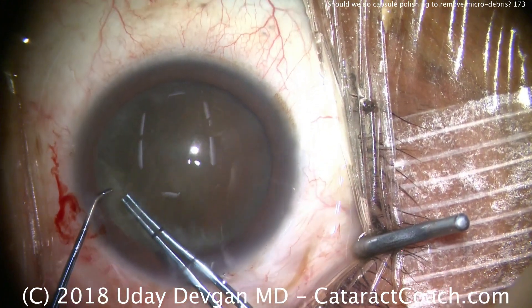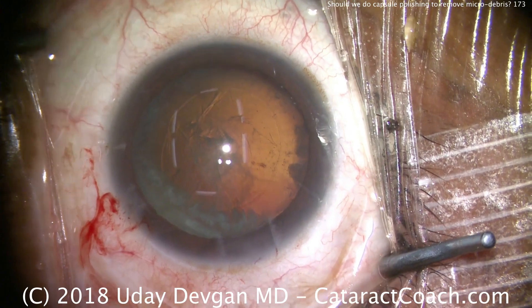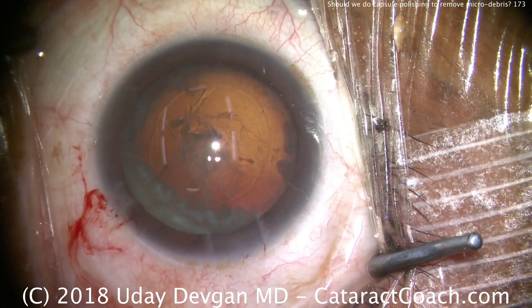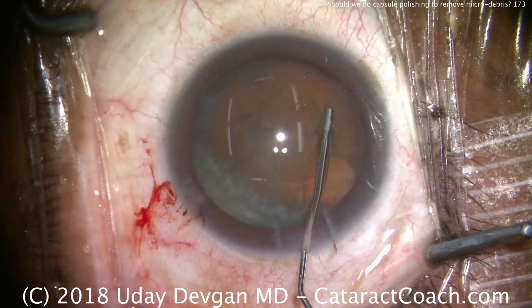Here we go, completing our capsulorhexis. Also, in a case like this where you don't have the best red reflex, you definitely need to adjust the microscope settings — as I've done here — to bring a stronger red reflex in.